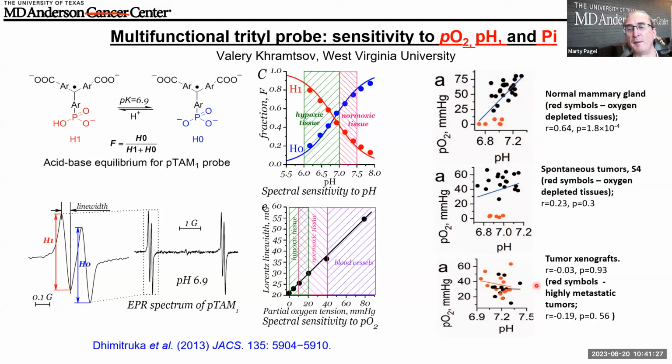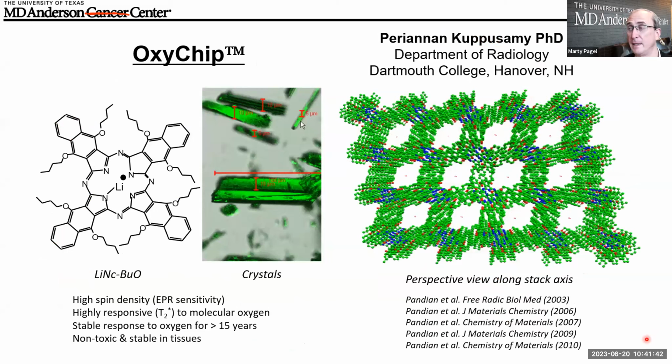And you really have to understand your system and see if there's a direct correlation or not, because sometimes two different metabolic processes don't always crosstalk to each other very strongly. So I think it's a wonderful result. So can we get this to work in the clinic? Well, the answer is yes.